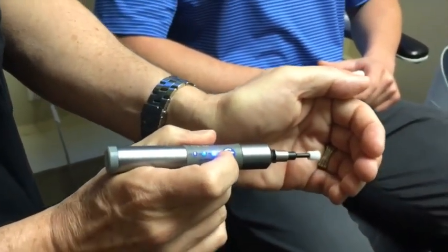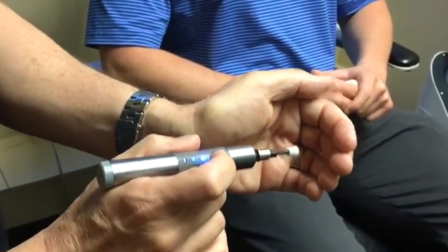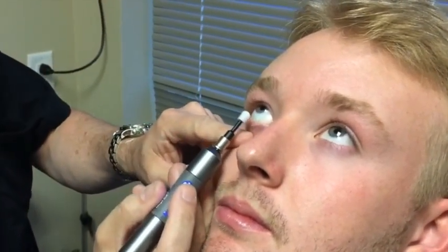I shield the patient so I don't splatter the foam all over the patient, and we turn right to the patient and begin to go to work. Now, you'll have the patient look up towards the ceiling. I take my non-dominant hand, I pull down the lid margin, the lower lids where I typically like to start, and I bring my hand in nice and flush to the face.